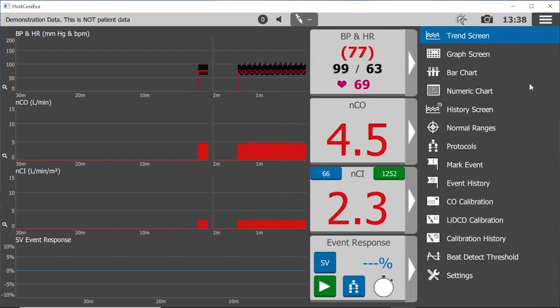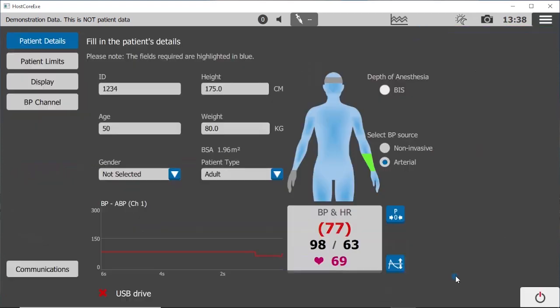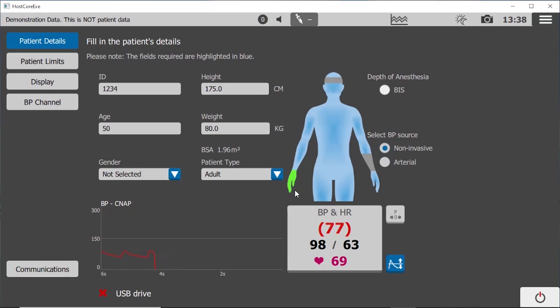Pressing the main menu key will reveal a variety of functions, including settings. So if your patient doesn't have an arterial line, here's the non-invasive option for BP source. But that's a different video.